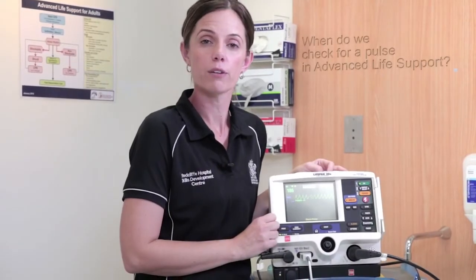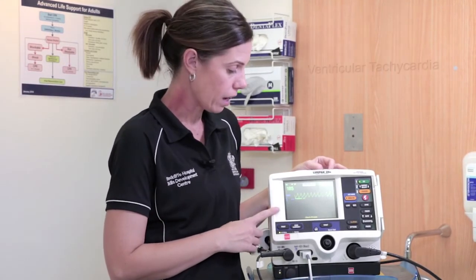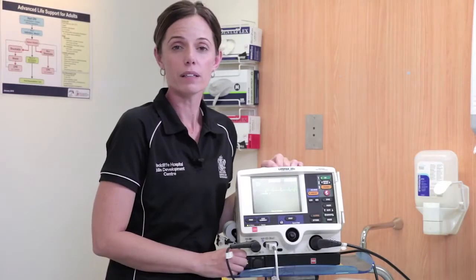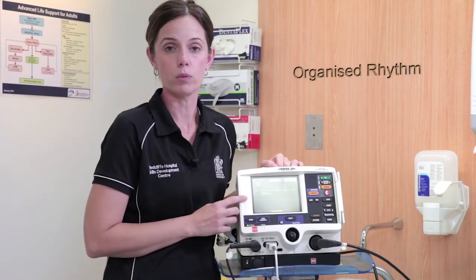When do we check for a pulse in advanced life support? If we analyse a ventricular tachycardia, we need to check for a pulse. If we analyse an organised rhythm, we also need to check for a pulse for any return of spontaneous circulation or a PEA.